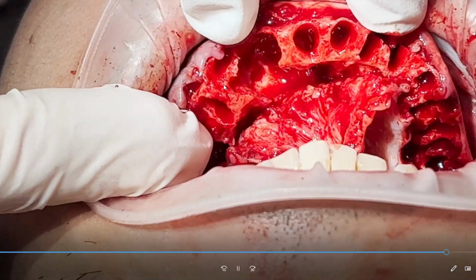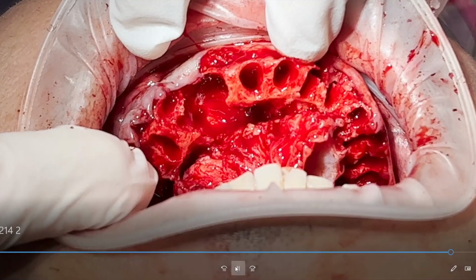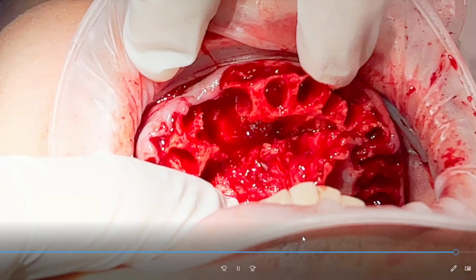So what is left? We got a huge cavern here, right? Let's take a look here. We have nice sockets here where we could just drill right in and place an implant. We couldn't even use this socket because right underneath here there's a bunch of bone loss. This is completely undermined. I actually did try to place an implant in this area, and this bone just completely crumbled. So I placed another implant right over here, another one right over here, and the other one right over here. We had to skip this whole area because that infection completely destroyed this wall of bone and also ate away all this bone underneath. That made the process extremely complicated.